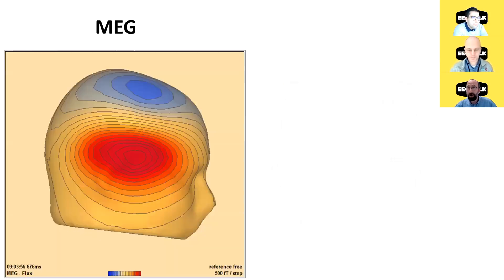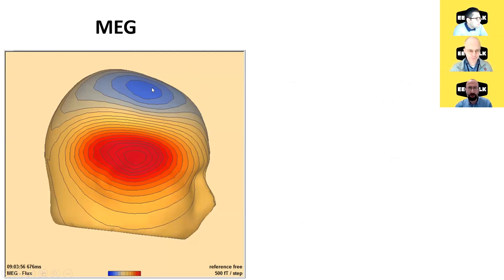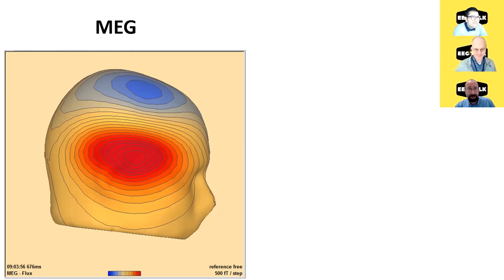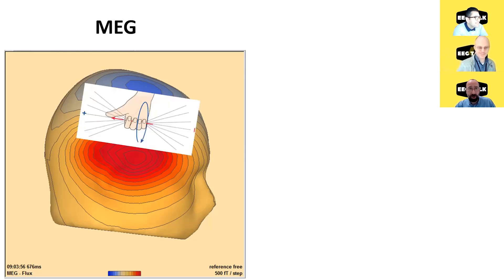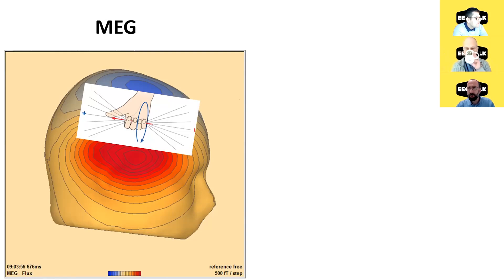To convince you, let me show you an MEG, because magnetoencephalography is not biased by the common recording reference electrode phenomenon we have in EEG. The color codes here show where the magnetic field goes into the brain — blue is the magnetic field going in, red is coming out. You might remember the right-hand rule from high school physics, which shows the relationship between the direction of the magnetic field and the electric current.